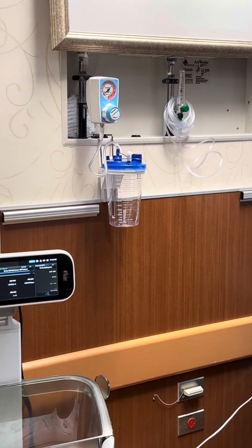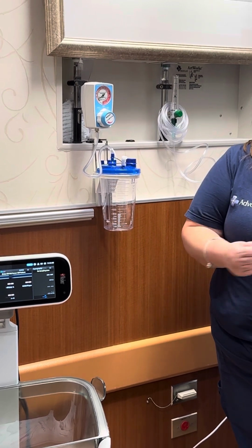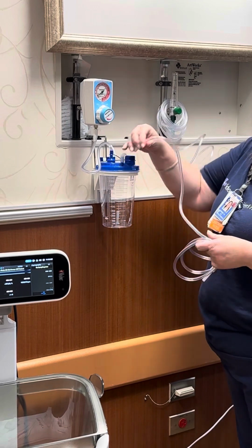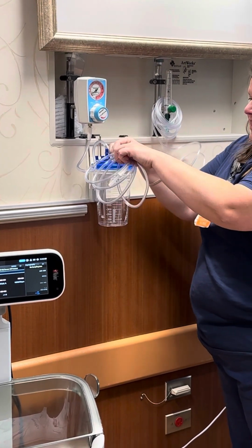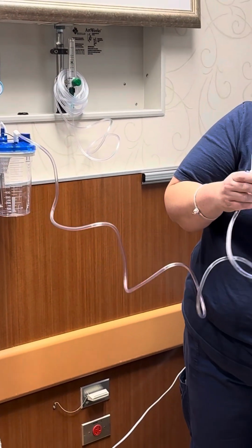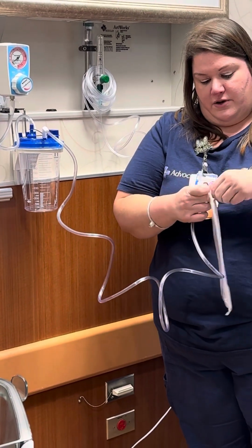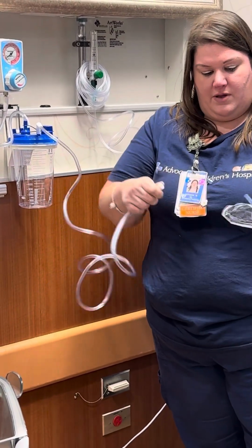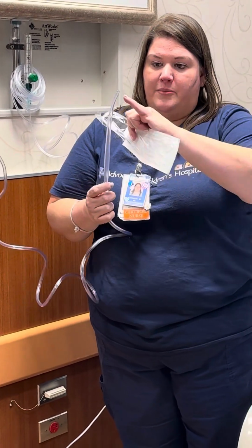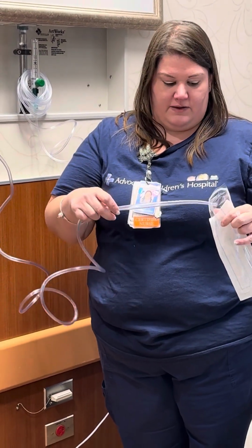You're also gonna open a longer set of tubing, and this is what you would use if you had to suction the patient. So you're gonna open this up. You're gonna connect to the white L-shaped connector on the top, and then you have your tubing. The last piece to this is your Yankauer or your mouth suction piece. So you're gonna open this, pull out your port, put your Yankauer in there, and this is what you would use. The part that has the little holes at the top is what you use in the patient's mouth, so just make sure you connect the right end.